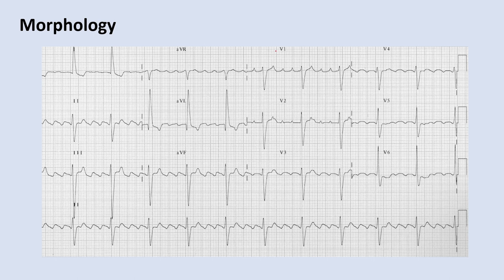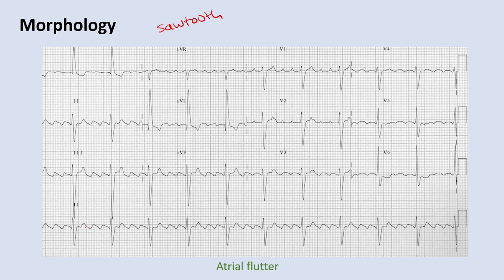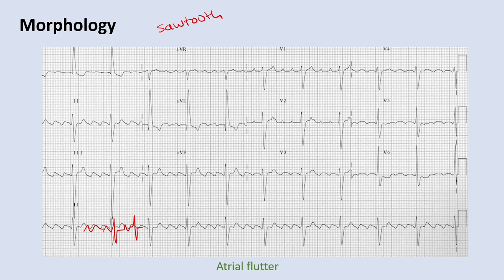This is a similar pattern but with a more regular rhythm and sawtooth baseline patterns — this is atrial flutter. With atrial flutter you can have a specified block ratio. Here you can count one, two, three, four flutter waves per QRS — that's a four-to-one flutter with a four-to-one AV block. You can also get atrial flutter with variable AV block, giving a regularly irregular heart rate despite the underlying flutter.